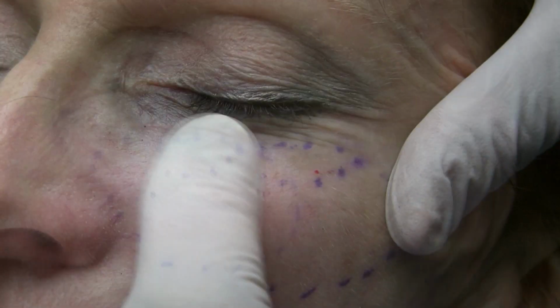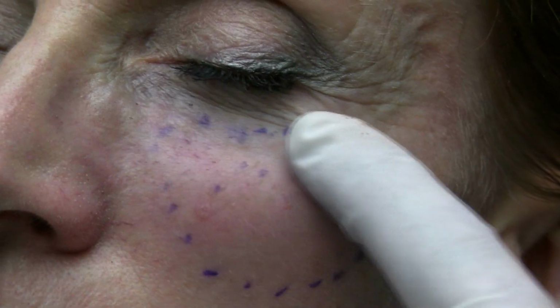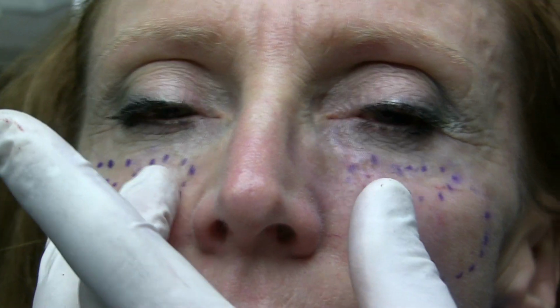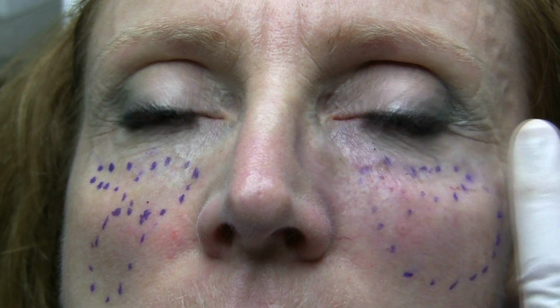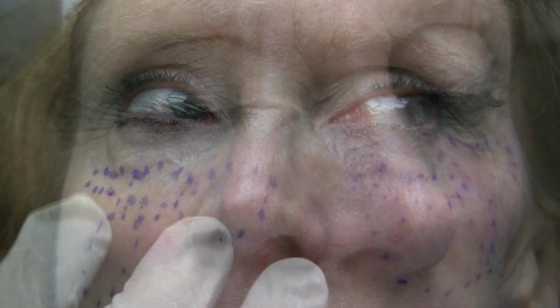So massaging this now, we have put 1 cc in this infraorbital depression in her tear trough. We may come back and put a little bit more, but if you look at this side versus this side, I believe you can see the difference. She has some nice malar or submalar anterior maxillary infraorbital projection now. And so we'll proceed on the other side.